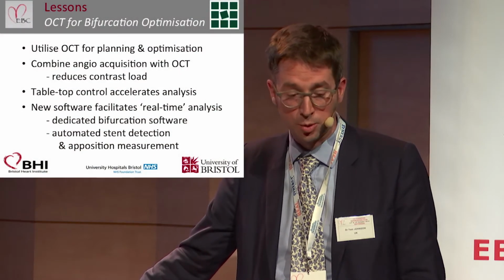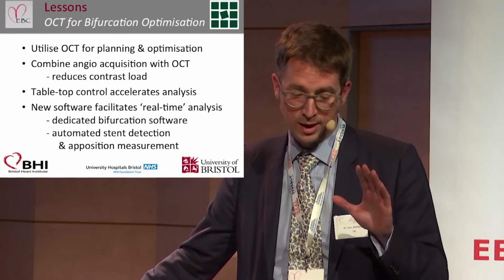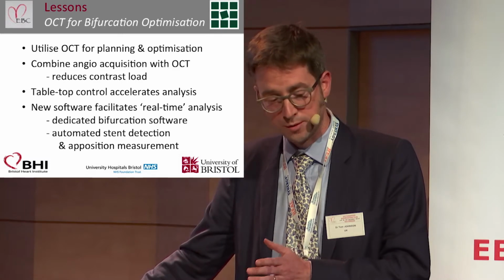So I hope you agree, having seen those demonstrations, that clearly OCT does play a role, and there's clear utility for both the planning and optimization. We heard earlier in the first session that quite clearly OCT plays a role both in the planning and in the deployment of stents.